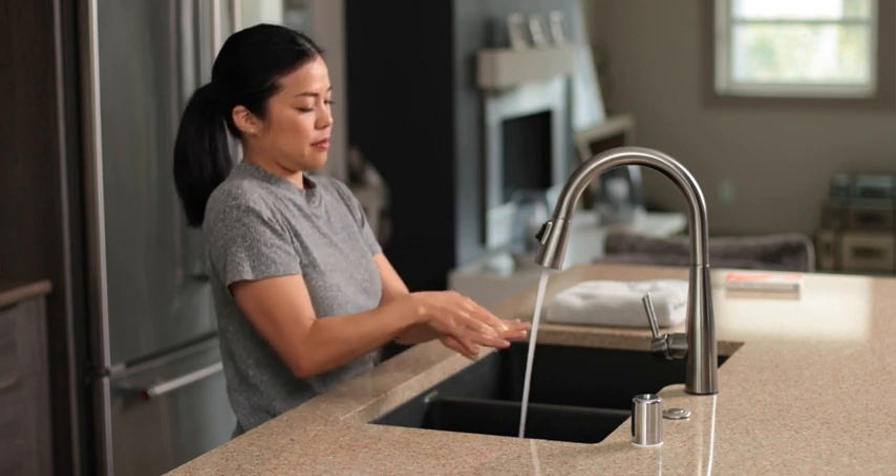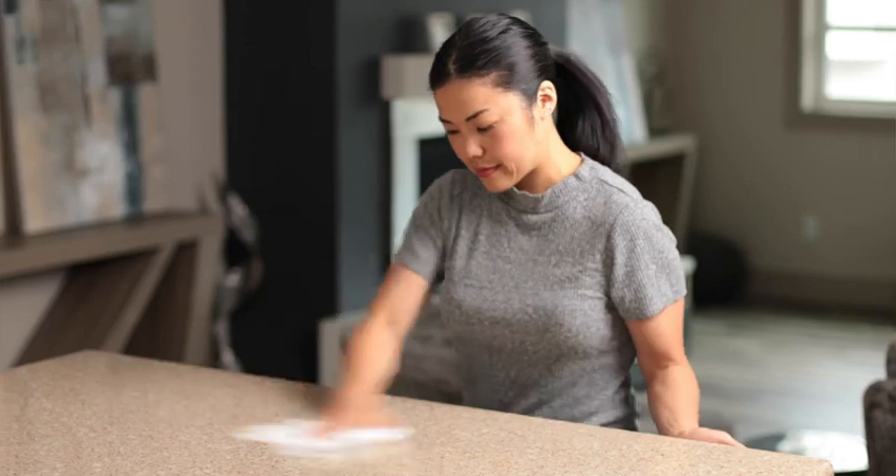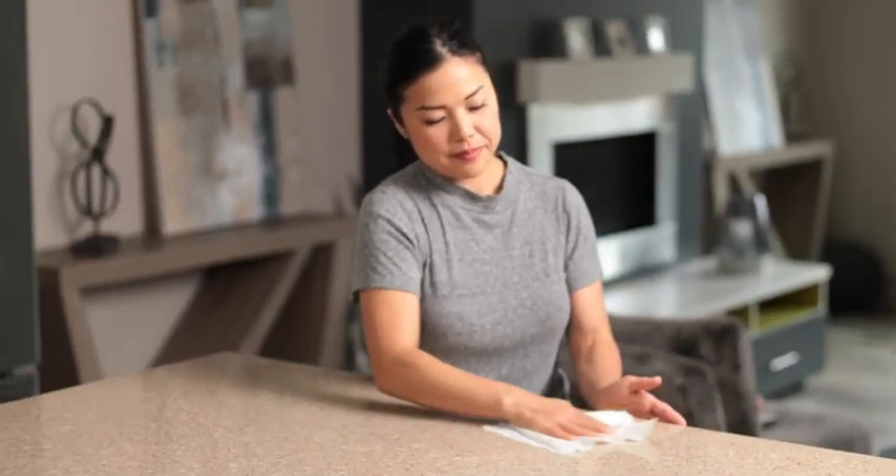For starters, thoroughly wash your hands with soap and water. We also need a clean, flat testing area. Take a moment to disinfect some counter or tabletop space.